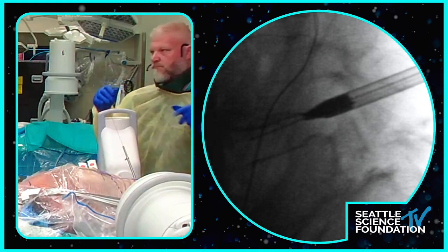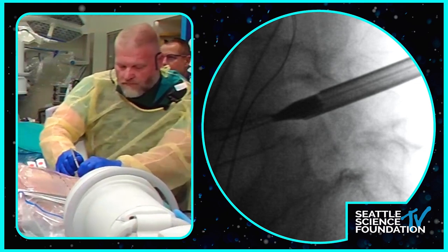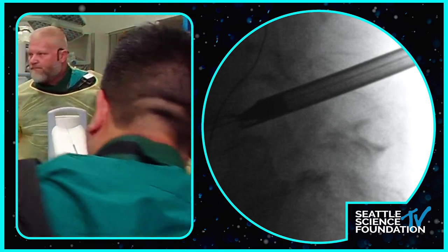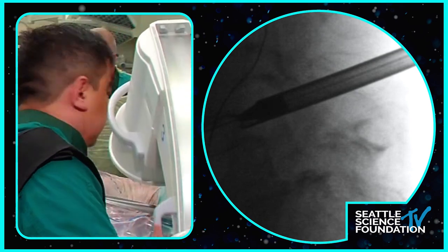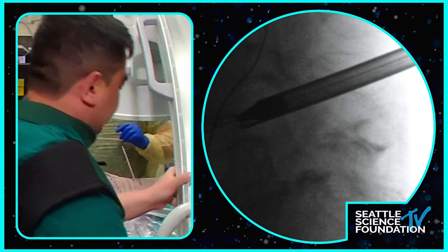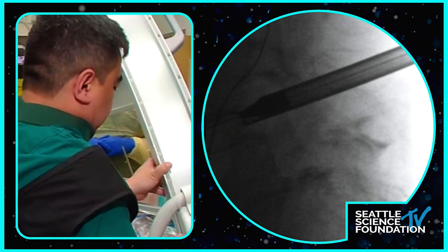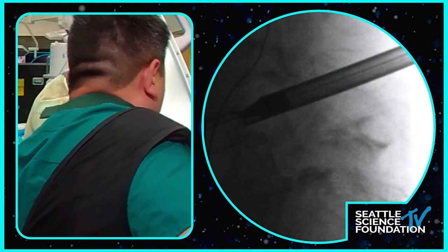If you don't have that pre-op MRI, like in this cadaver, you can do a lateral fluoroscopic X-ray with the measuring wand to the center of the disc, making sure you're completely perpendicular to the beam of the fluoroscope. Then you measure the distance where the posterior skin in that plane intersects that measuring device. That's the distance you would measure on the MRI from the skin for 45 degrees, which is kind of what you want for the fusion.